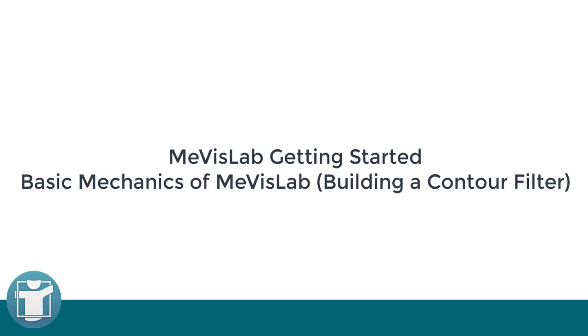In this video, you will learn the basic mechanics of the Mevislab IDE. You will learn how to reuse existing modules to load and view your data.